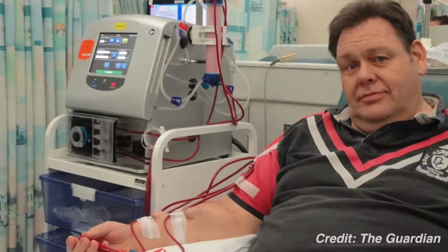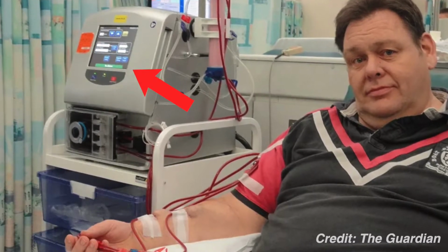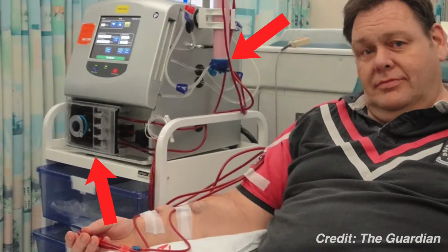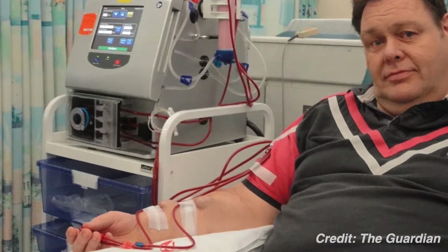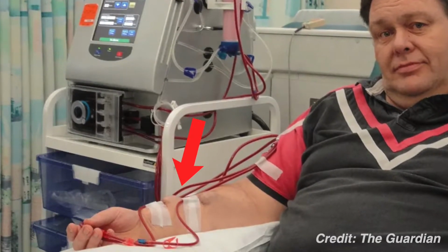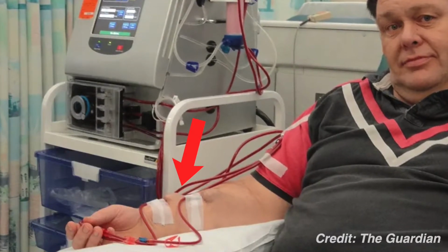A modern dialysis machine has two components: the machine itself, which pumps the blood to and from the patient, and the dialysis circuit, which contains the hemodialyzer, or essentially the artificial kidney. First off, a patient requires access. An artery and vein are joined to create a high-flow system, and in others, an artificial tube can be placed to allow for this high-flow system needed.